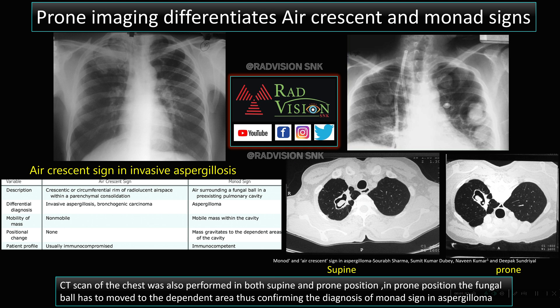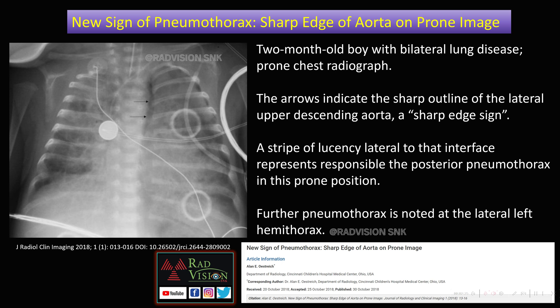Prone imaging also helps differentiate air crescent sign from Monod sign. This is air crescent sign and this is Monod sign. Here there is a pre-existing cavity with a fungal ball — in supine there is free movement of the ball, and this is confirmed in prone. A mobile mass within a cavity suggests Monod sign, seen in immunocompetent patients — typically aspergilloma in a pre-existing pulmonary cavity. If the mass is not mobile in either position, it is most likely air crescent sign, seen in immunocompromised patients with invasive aspergillosis or bronchogenic carcinoma.